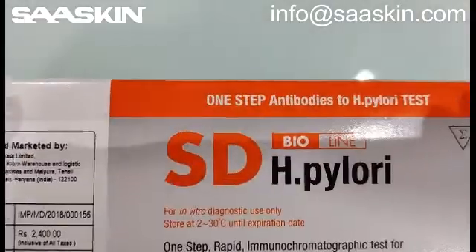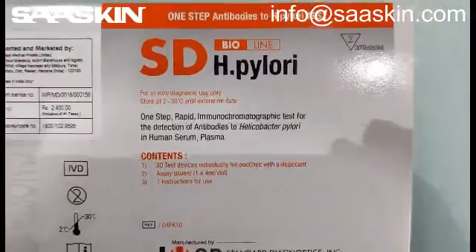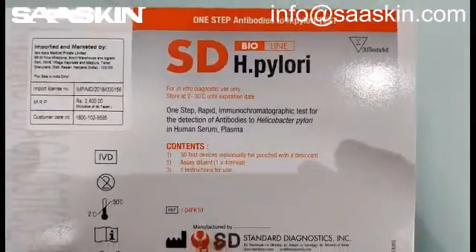Just to show you in detail, it's a one step antibody to H Pylori test and there are 30 test cassettes in this kit.